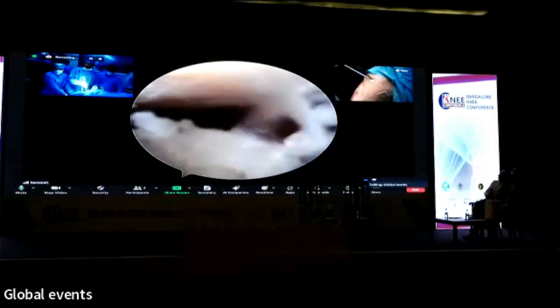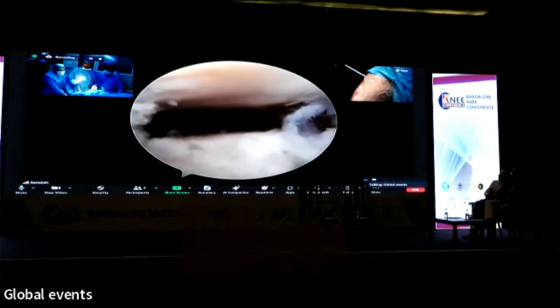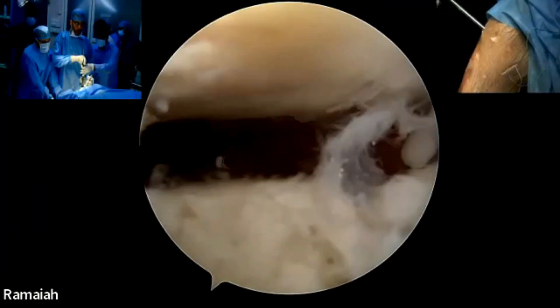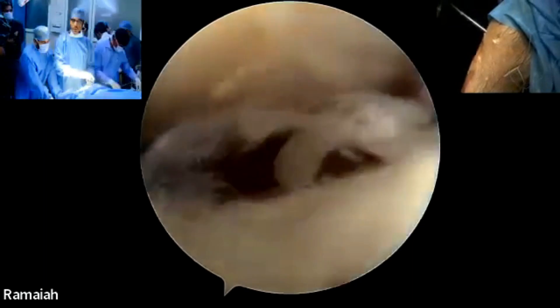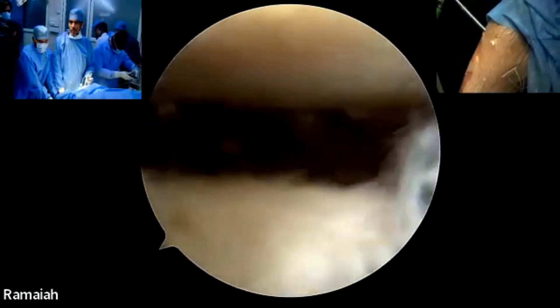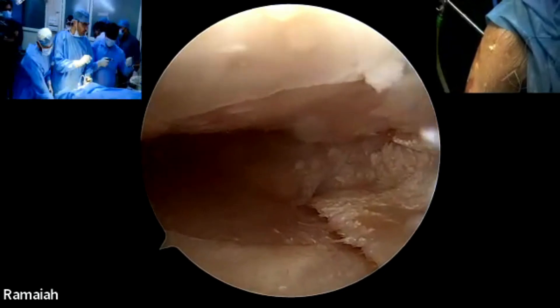When you have ACL with meniscus repair, the sequence is: first you complete your ACL femoral tunnel. When doing ACL and meniscus together, I try to put the ACL femoral tunnel first and keep the meniscus ready. I do the meniscus repair once the femoral tunnel is done.